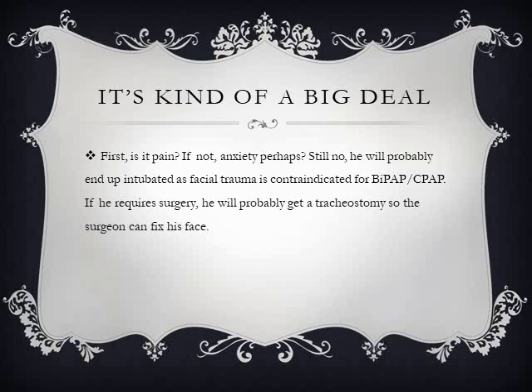Well, first, if it's pain, pain meds might help. If not, could it be anxiety? If not, probably end up intubated as facial trauma is contraindicated for a BiPAP or CPAP mask. If the patient requires surgery, they're probably going to do a trach so the jaw can be wired shut and the surgeon can fix any other issues that could require surgical intervention.